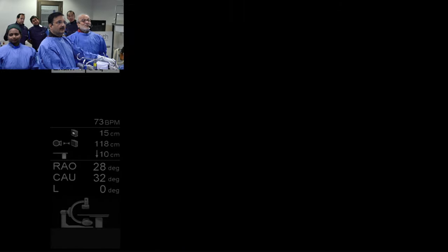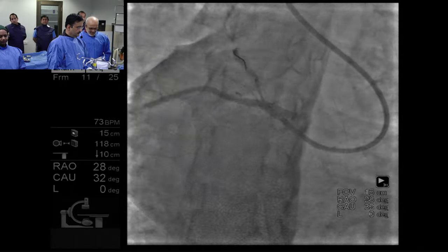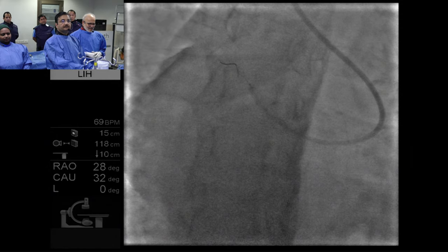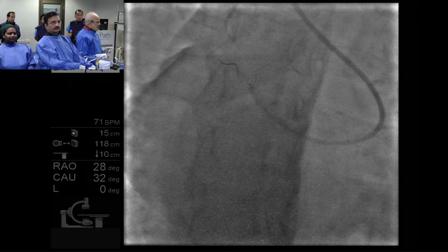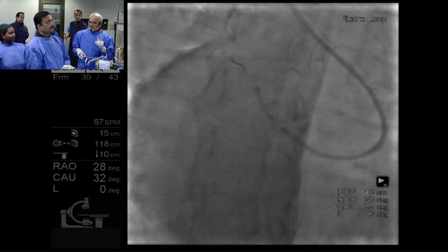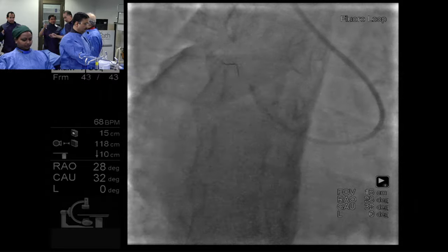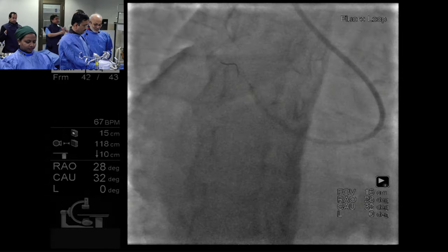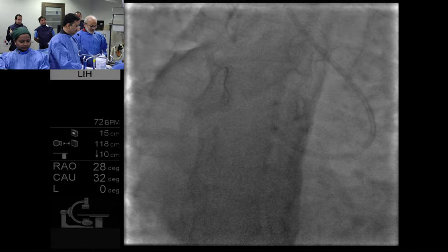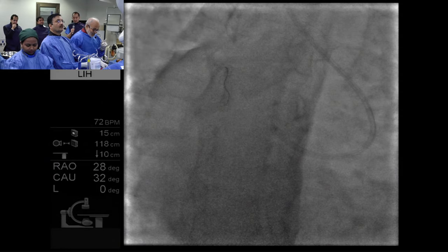Just for the discussion's sake, can you tell what we are going to see in OCT? Whether the calcium is superficial or deep, is it 180 degrees or what? Khaled and Malcolm, we were discussing this last night. I think this would be both superficial and deep. When you see it on fluoroscopy, clearly it probably is both superficial and deep. Good question, good answer, good discussion.